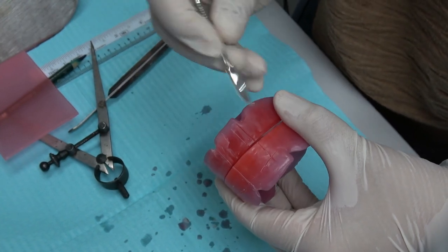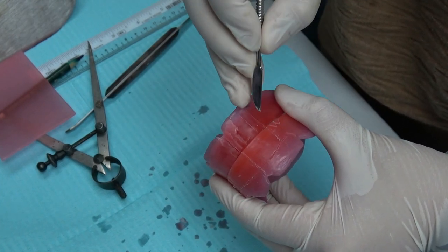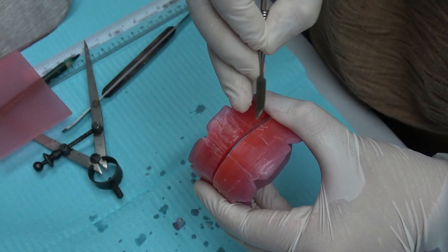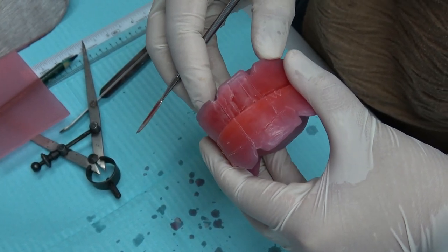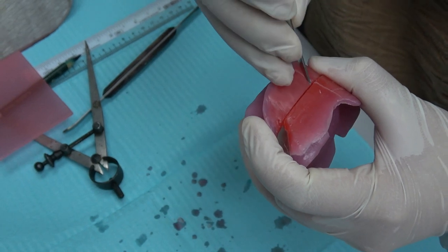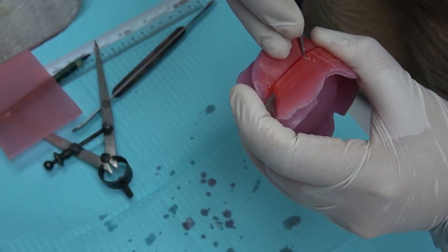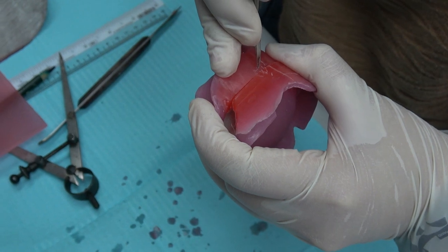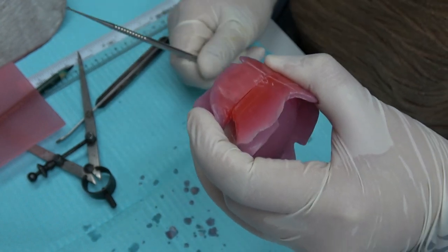Now you make a V notch on the premolar area. You just mark it first. You can make 2 V notches, and a trough below it. Just a small trough. So make sure it coincides. Same thing on the left side. 2 V notches. You draw like this, and then a trough. This is as a guide so that when you place it back in the phantom head, it should coincide together.